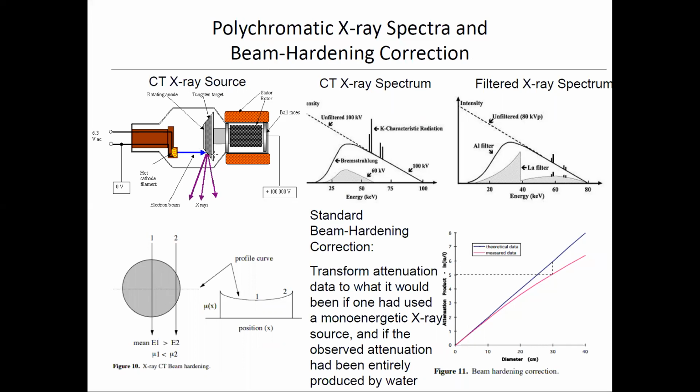So the challenge is having these spinning sources where the tungsten source will move away, so as not to give it time for the heat to dissipate from the spot that you just hit, so it doesn't melt through the source. So all this is an advanced developed technology, all the collimation of beam line associated with the X-ray source, and it's a whole division of the company in and of itself that will make the X-ray sources. So they consist of basically making an electron beam that's going to strike the target, tungsten target, and make this type of Bremsstrahlung with the spectrum.